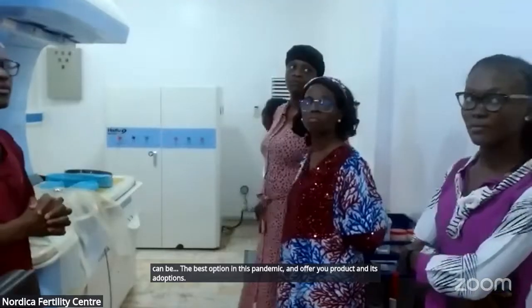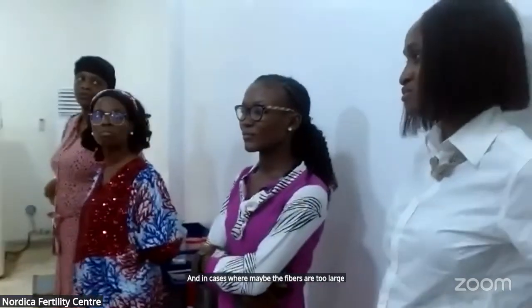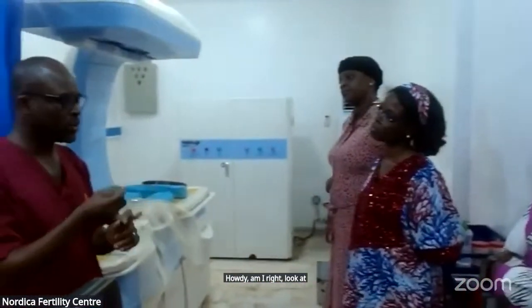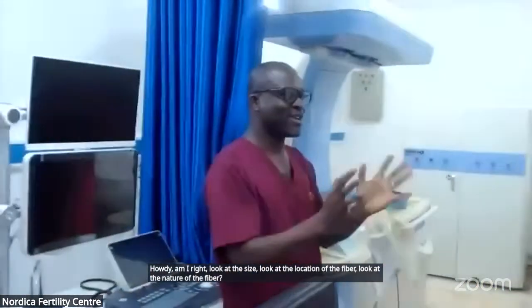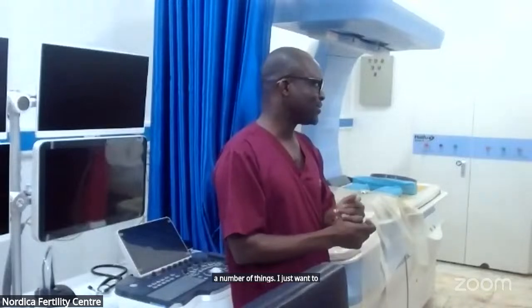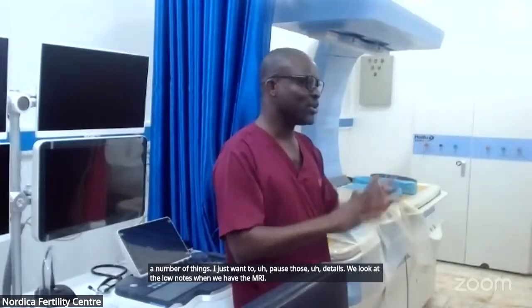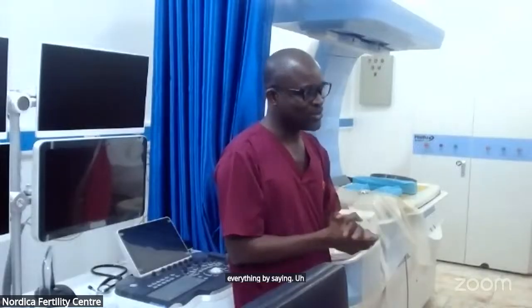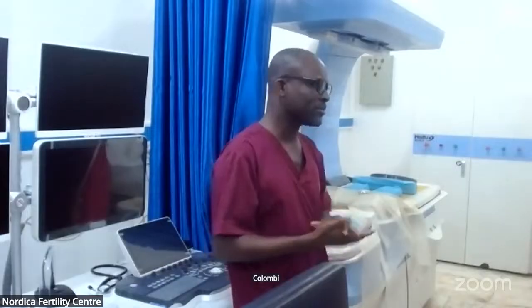In cases where the fibroids are too large, people may not be suitable, so we look at all of that. When we have the MRI, we look at the size, we look at the location of the fibroid, we look at the nature of the fibroid, a number of things. I just don't want to bore us with those details. We look at the whole lot when we have the MRI, and I just summarize by saying whether you are suitable or not.